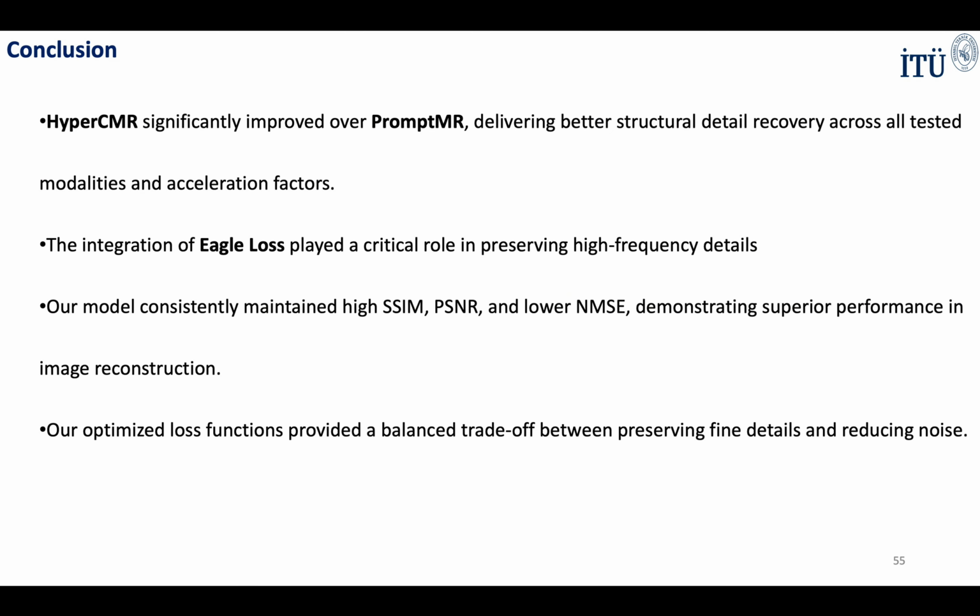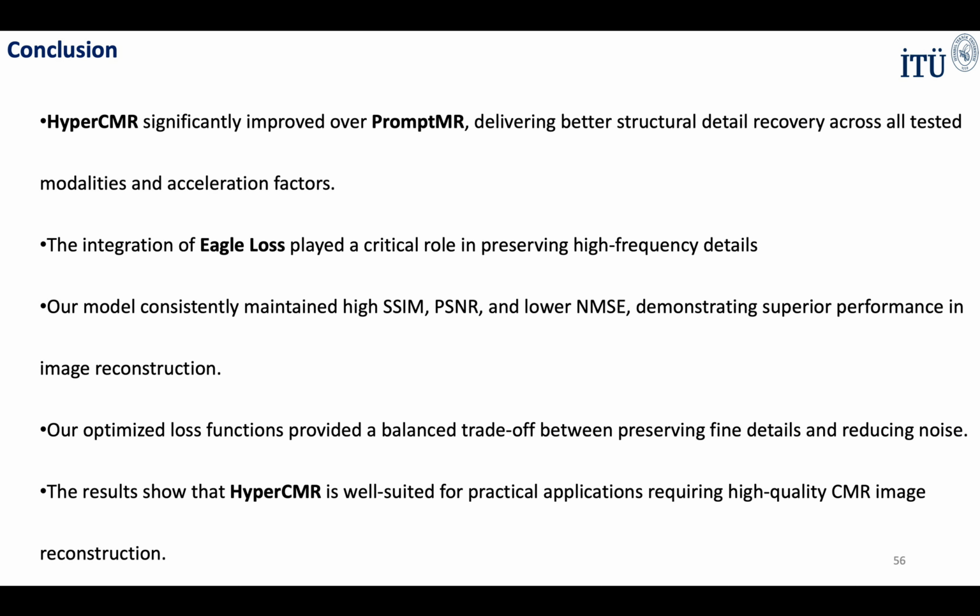The optimized loss functions provided a balance between recovering fine details and managing noise, proving to be highly effective for image reconstruction tasks. With these improvements, HyperCMR is highly suitable for real-world applications requiring accurate and high-quality CMR reconstructions, showing its potential for clinical and research applications.